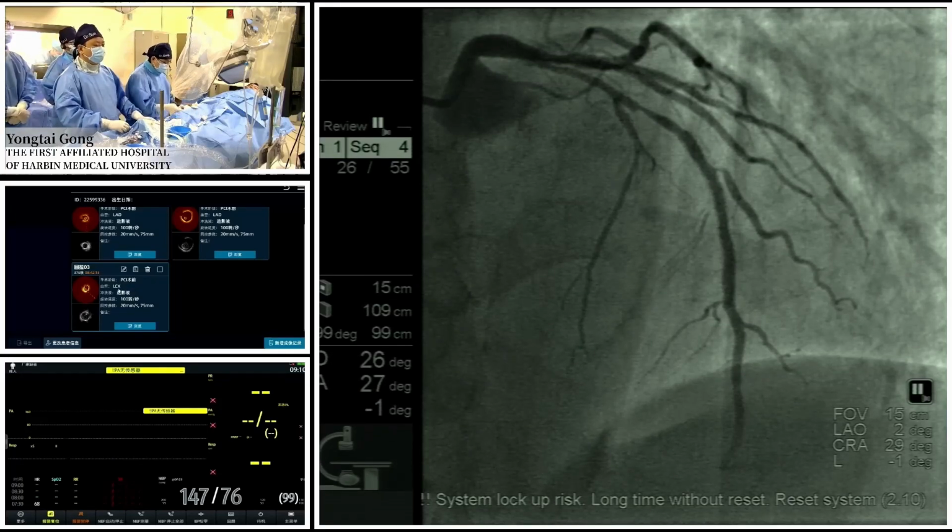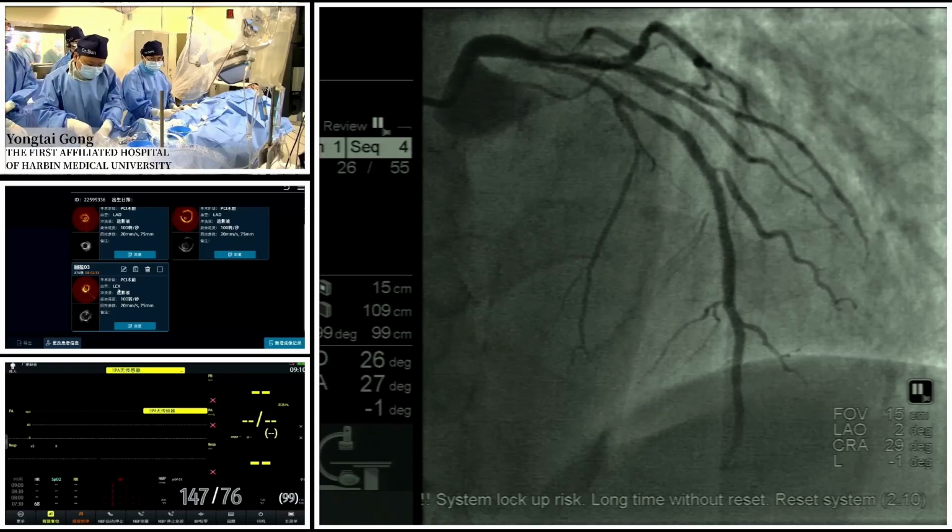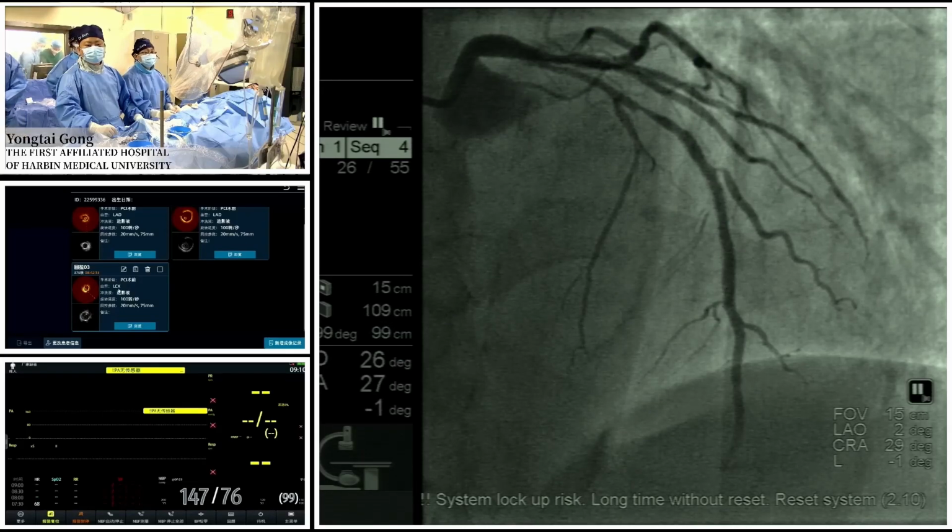Yeah, for this kind of lesion, the imaging test is super important. But both IVUS and OCT have their pros and cons. But right now we have an integrated imaging system. I think this is a genius idea. It was invented by a Chinese company. So with this system, we can make full use of their strengths and counter their limitations. So I think Dr. Johnson will interpret the imaging results of the integrated imaging system for us.